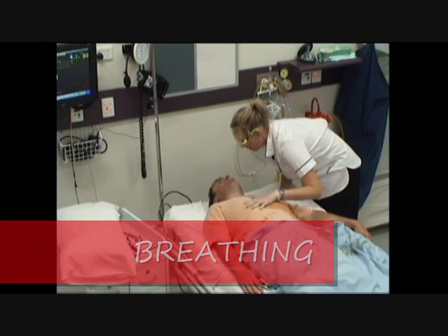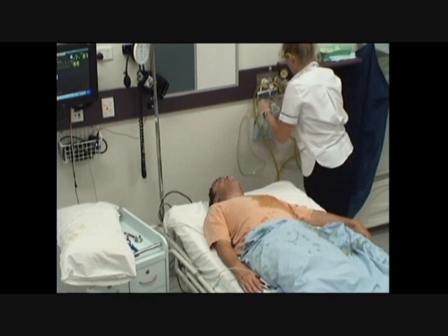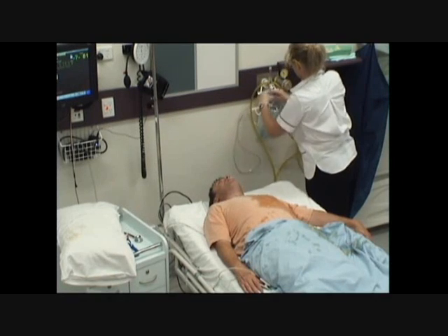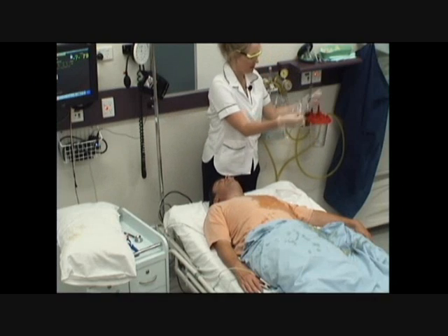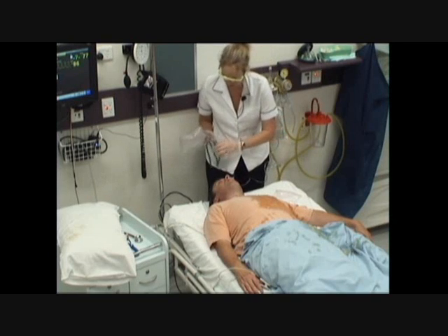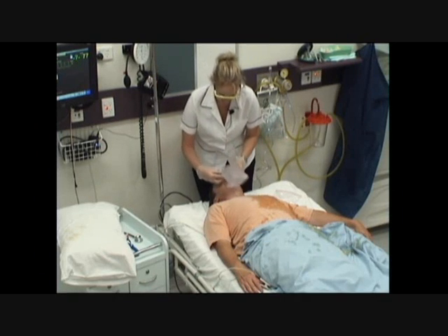When assessing the patient's breathing, look, listen and feel for about 10 seconds, assessing their respiratory rate and also their oxygen saturation level. The nurse then applies the non-rebreather mask, as this provides a higher concentration of oxygen as is needed for the critically ill patient. There are a variety of oxygen masks available. Assess your patient and decide which is most appropriate for them. The nurse ensures that the reservoir of the non-rebreather oxygen mask fills with oxygen before applying it to the patient.